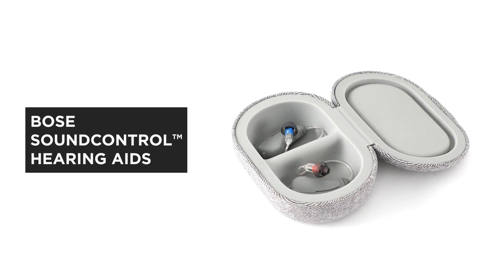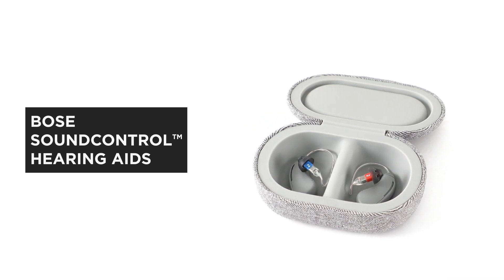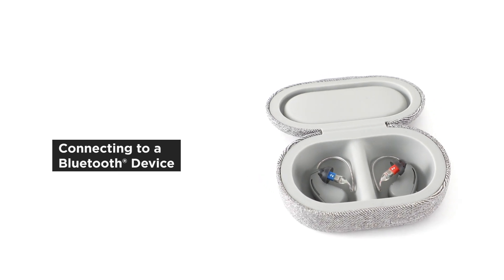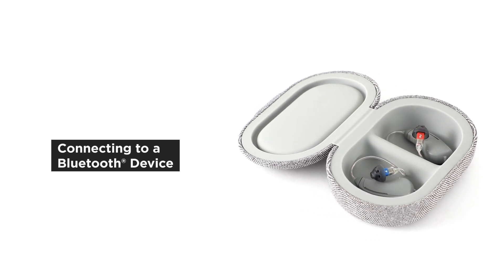Bose SoundControl hearing aids are the first of their kind to offer clinically proven self-tuning through the Bose Hear app. In this video, we'll help you connect your hearing aids to a smartphone or tablet via Bluetooth.